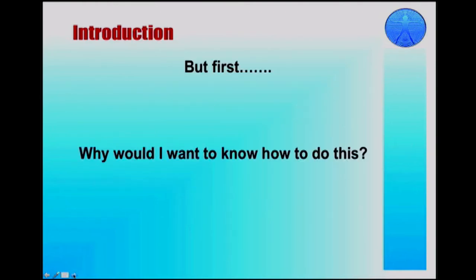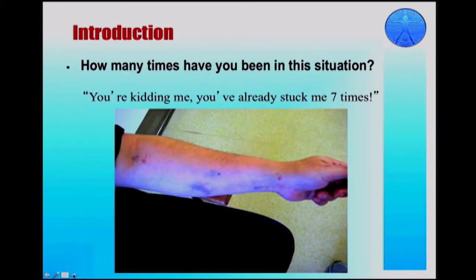But first, why would you want to know how to do this? Well, all of us have been in this situation where we've had patients where we couldn't get peripheral venous access using a blind technique. And patients have poor satisfaction when you have to stick them multiple times and still haven't obtained their blood or placed that IV.